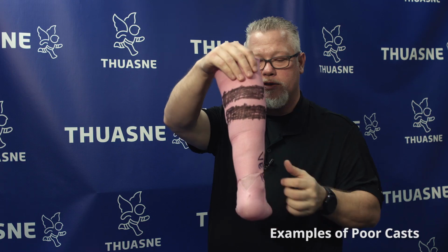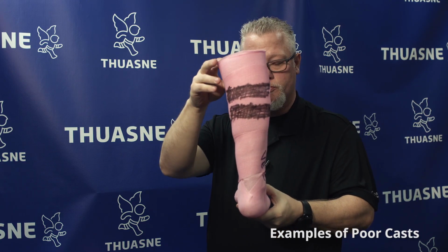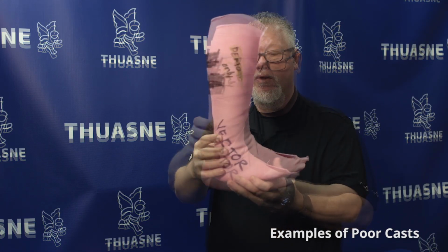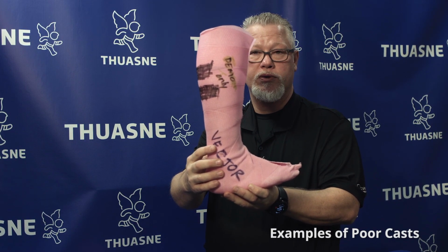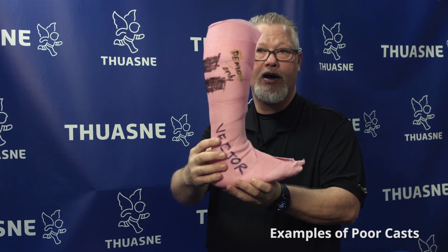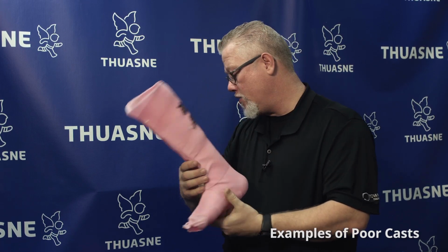So the forefoot in this particular cast is adducted, so we have a medial drift. If we flip, the hind foot is somewhat neutral, so that's good. And then we also are dorsiflexed, so we know that we have a negative heel height at this point. So this doesn't accurately reflect the heel height that was asked in the device.